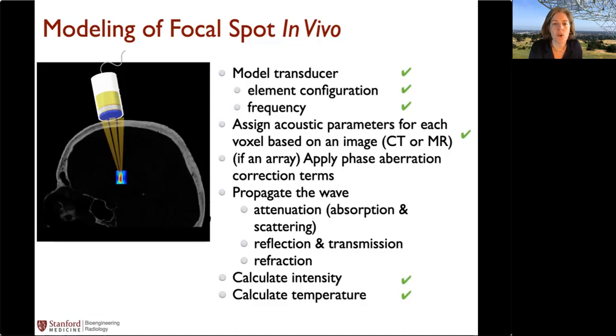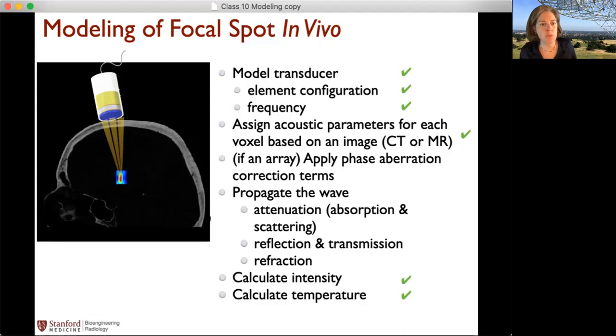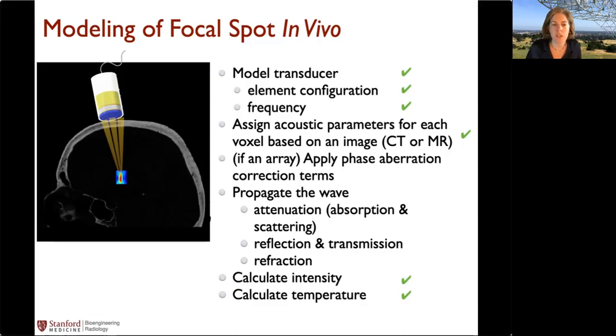Okay. So far I've talked a lot about CT. CT images are beautiful. They give you beautiful bone images. So there's a nice one there. And I could actually show you, or maybe I did already, some zoom in of CT images where you get beautiful detail of the bone, especially the trabecular bone. And CT is great for essential tremor patients who are 65 to 85. They can go and get a CT, and there's so much research these days on how to get low radiation dose CT that it's not really as bad as it used to be in terms of radiation dose.